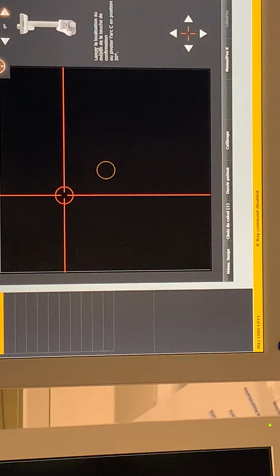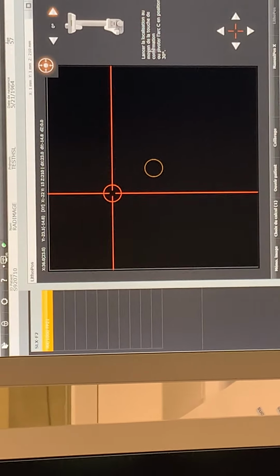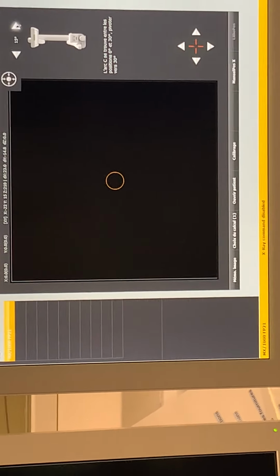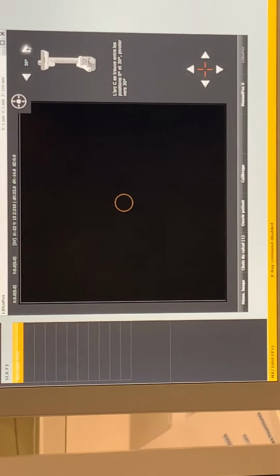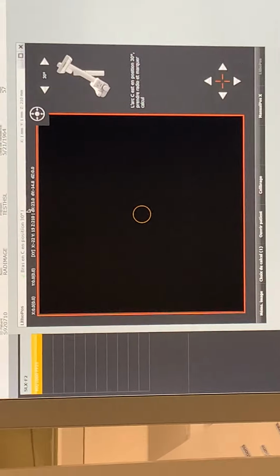Mark the stone, and now you are getting guided here. Everything is shown here. Now we will drive to 30 degrees. It stops at 30 automatically. Maybe we will hear the sound. Yes, the bing, and you have the command here. It is in the 30-degree position.